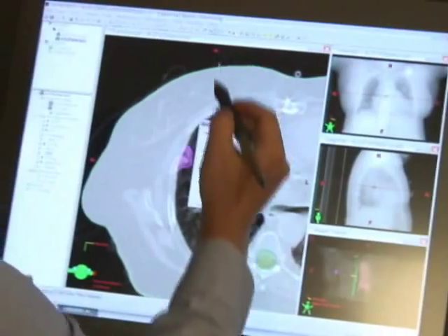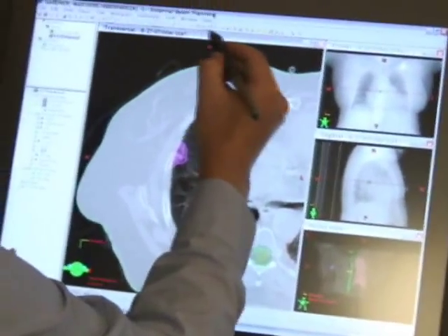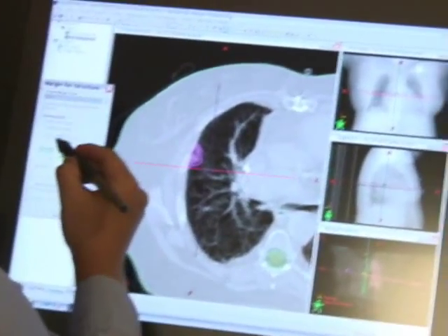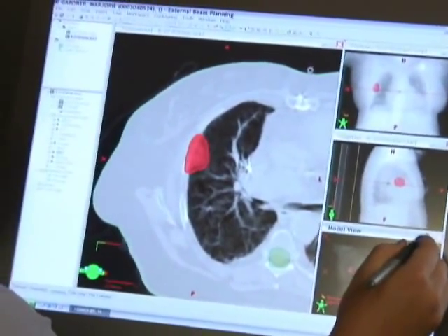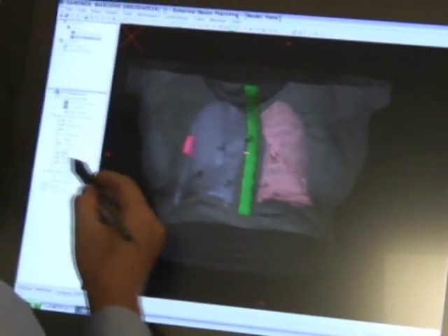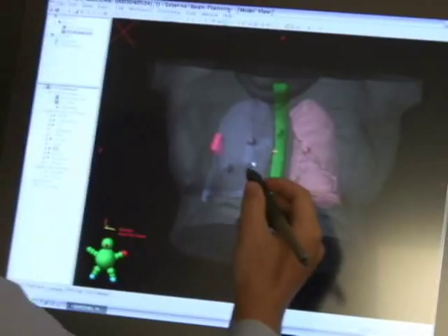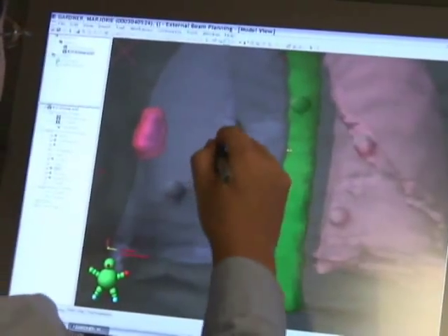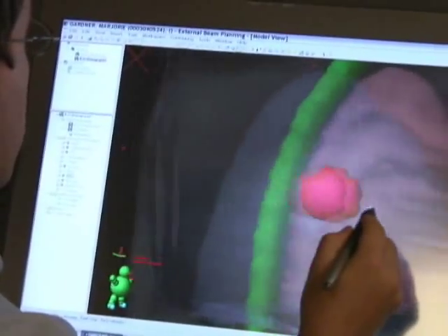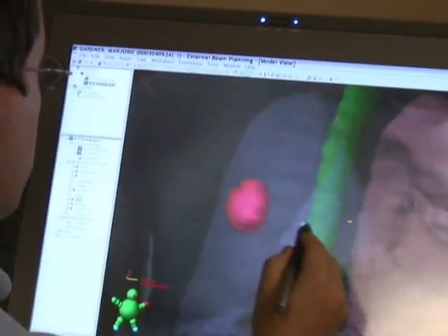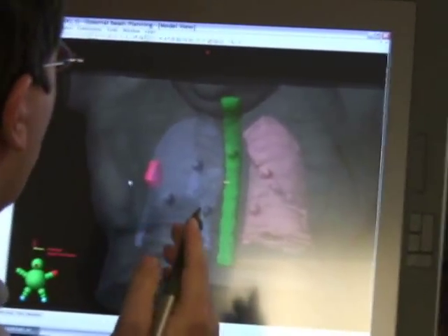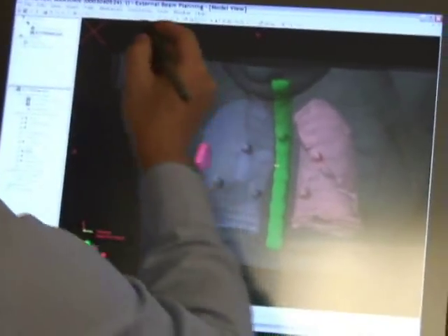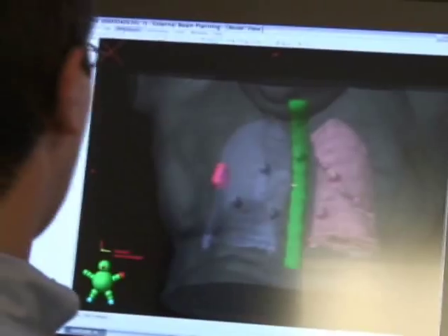This one I'm going to marginate with five millimeters, so we do that here. Here's our tumor plus margin, and here's our right lung — you can see the extent of the tumor there. My excellent dosimetrists have already contoured the normal structures I'm interested in, which in this situation is mostly just the ipsilateral lung, but we have the contralateral lung and the core plus margin contoured. So now we will go into planning.